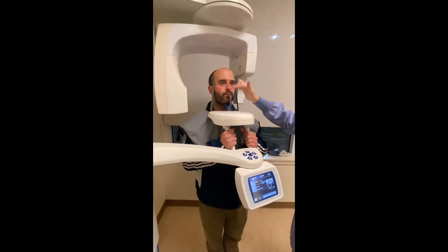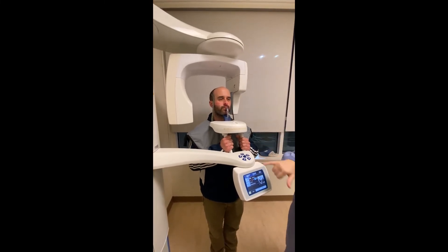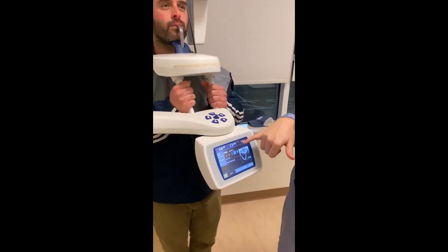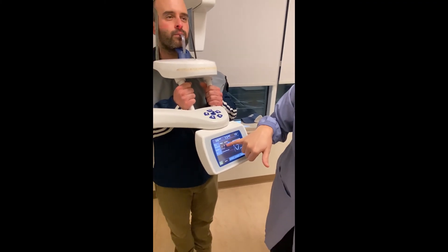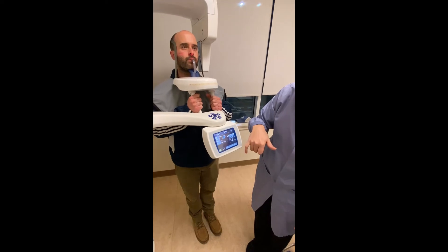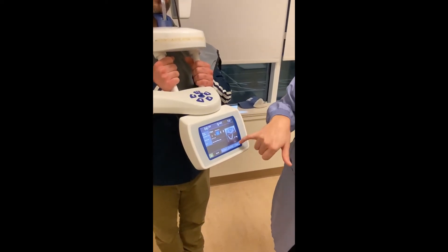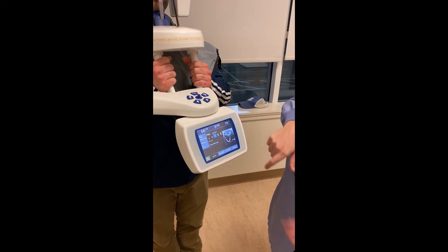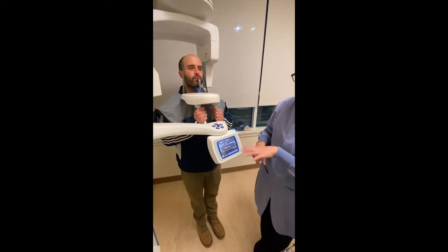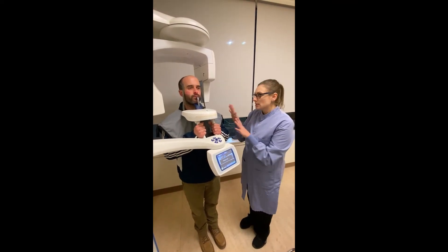Once all three lasers have been adjusted, check the exposure requirements for the X-ray. For a standard patient, select 66 kilovolts with 9mA and press ready. Once the light is blinking ready, it's a great time to give the patient their instructions.